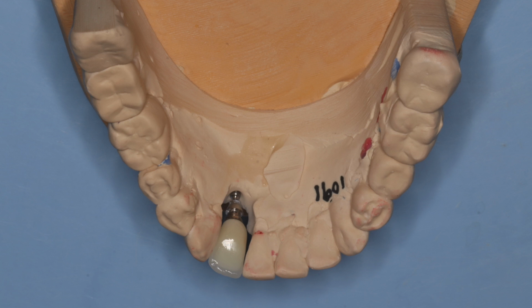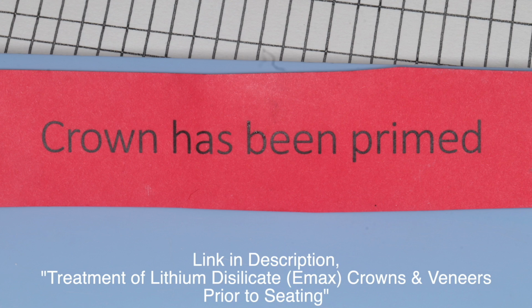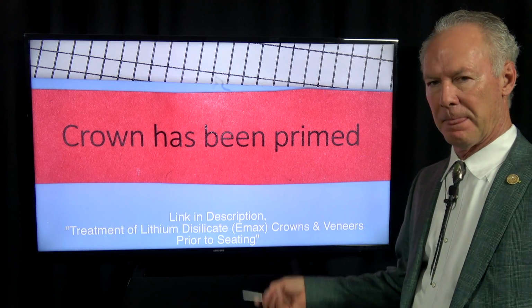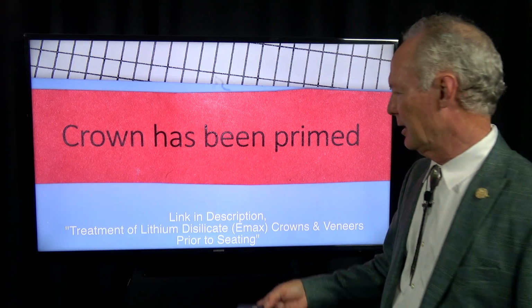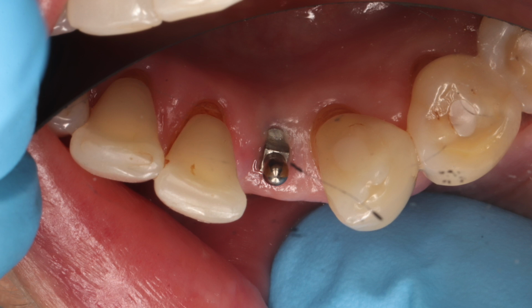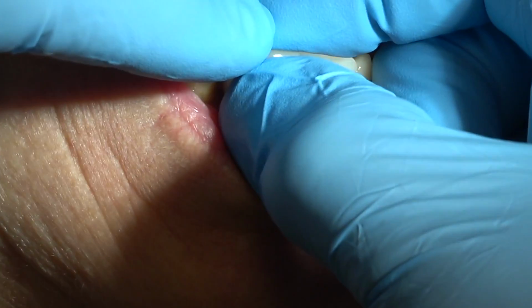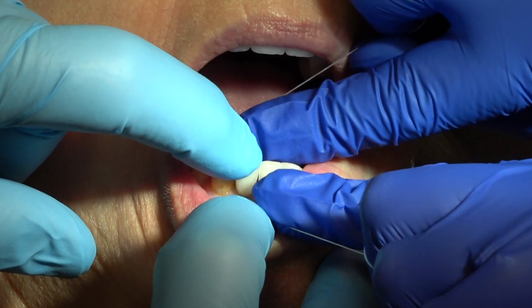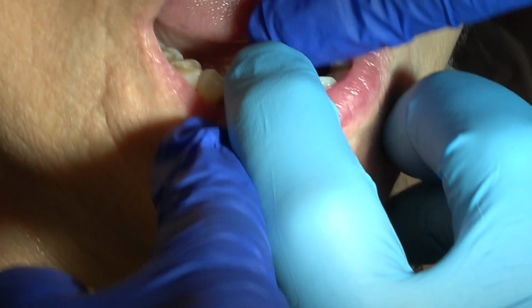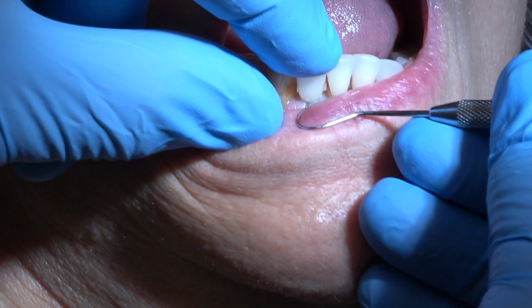Here's the final crown. This is an Emax crown. I want my technician to give me this with every crown to know the crown has been treated as you treat an Emax crown. You can refer to the link of how to treat lithium disilicate Emax crowns prior to cementation. Now, if you have any tissue that's grown over the shoulder, you may have to remove that tissue. You cannot remove it with electrosurge. You'd have to remove it with a blade so that the crown seats completely.